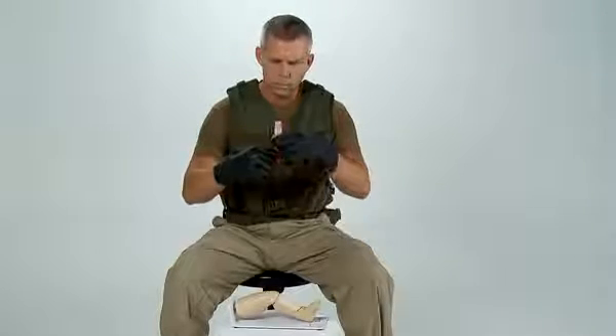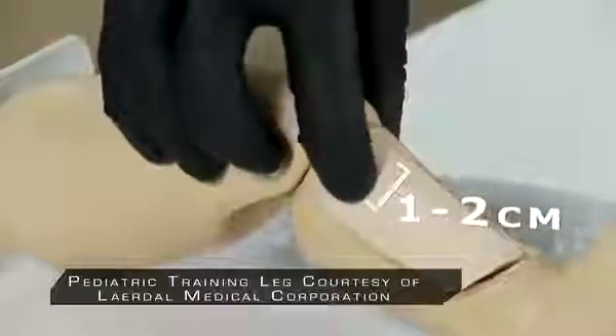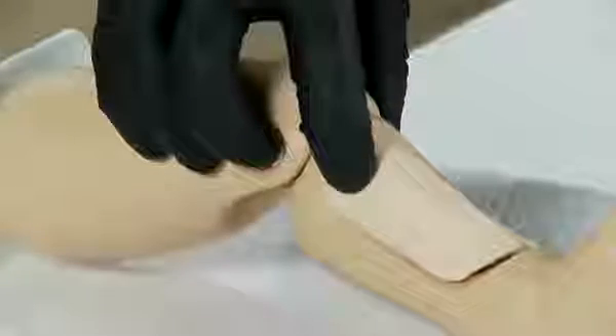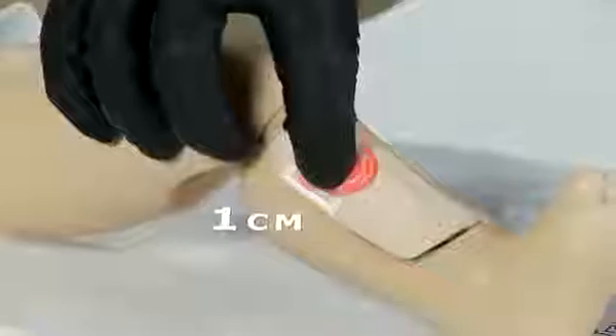For pediatric placement, find the same outset point, which is the tibial tuberosity. From the tibial tuberosity, go 1 to 2 centimeters toward the inner part of the leg to find the flat portion of bone called the tibial plateau. From the tibial plateau, go distally, or down toward the foot, approximately 1 centimeter, or half an inch.